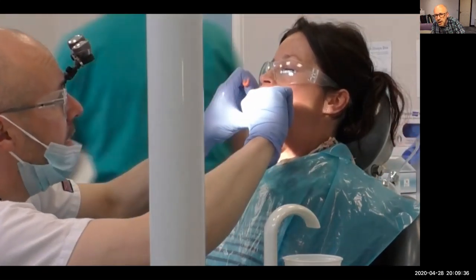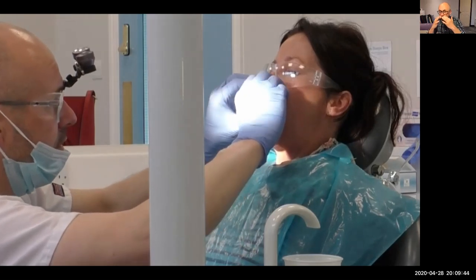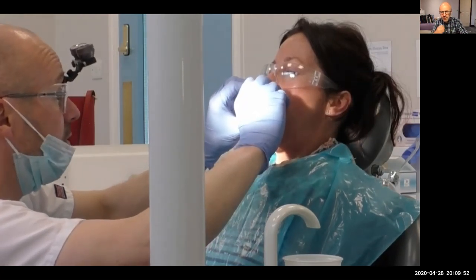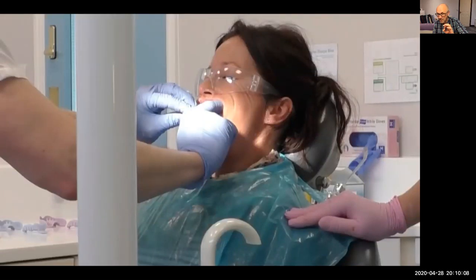And then I just gently feed the impression material, just by massaging the lips, up into the sulcus. So I'm recording that full depth of the sulcus, but I'm using a hypnotic voice for Donna while we're doing this, just to help her. And then I count it down with a stopwatch. When it's set, when it goes to 0, I then take it out like this. So here's Donna. I'm going to remove the impression now.